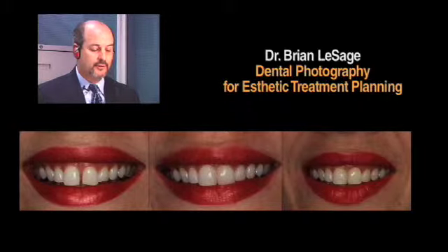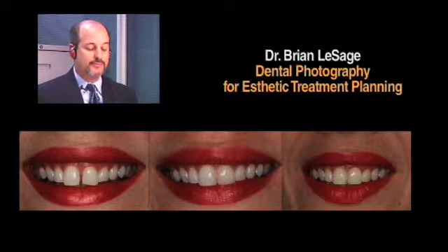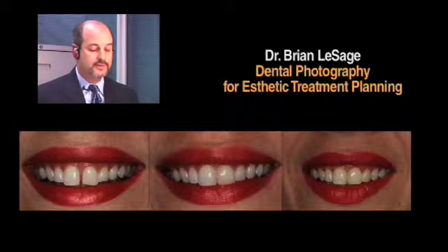So I go from here, the slide on the left, to here in about an hour and a half, probably this appointment. And then I take photographs. And the patient, it's already built into the fee that they're going to have a second appointment to come back and reevaluate this. And if you look here, all I did between the center view and the right view was add composite in this area here. That's all I did. And by adding composite in this area, here's the picture on the second appointment.